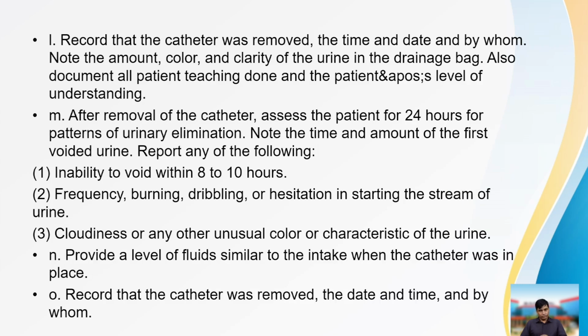Record that the catheter was removed, the time and date, and by whom. Note the amount, color and clarity of the urine in the drainage bag. Also document all patient teaching done and the patient's level of understanding.